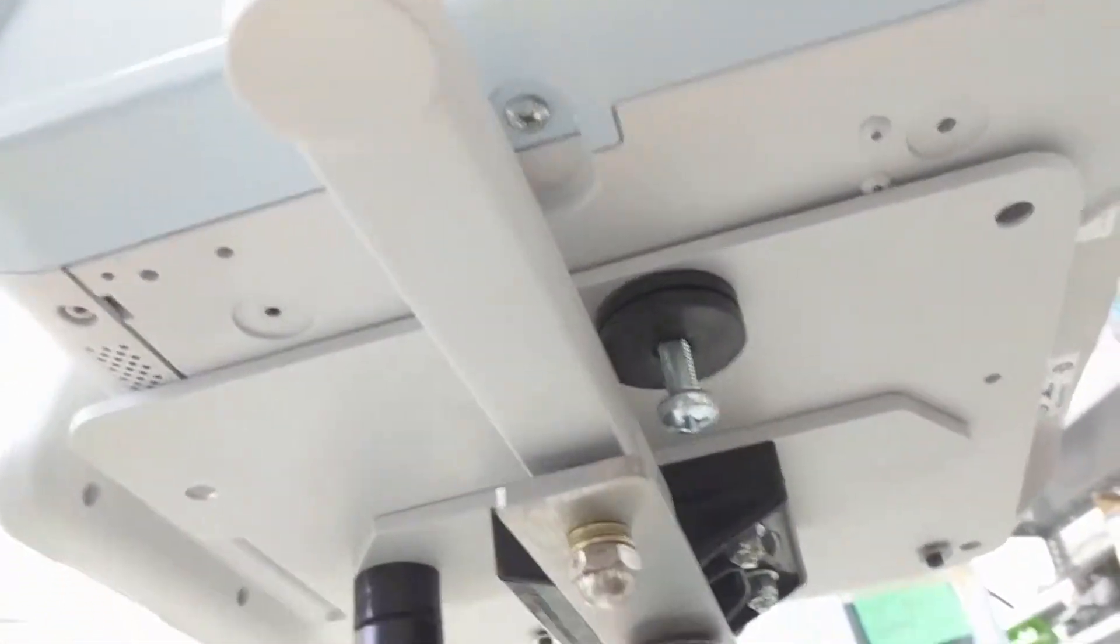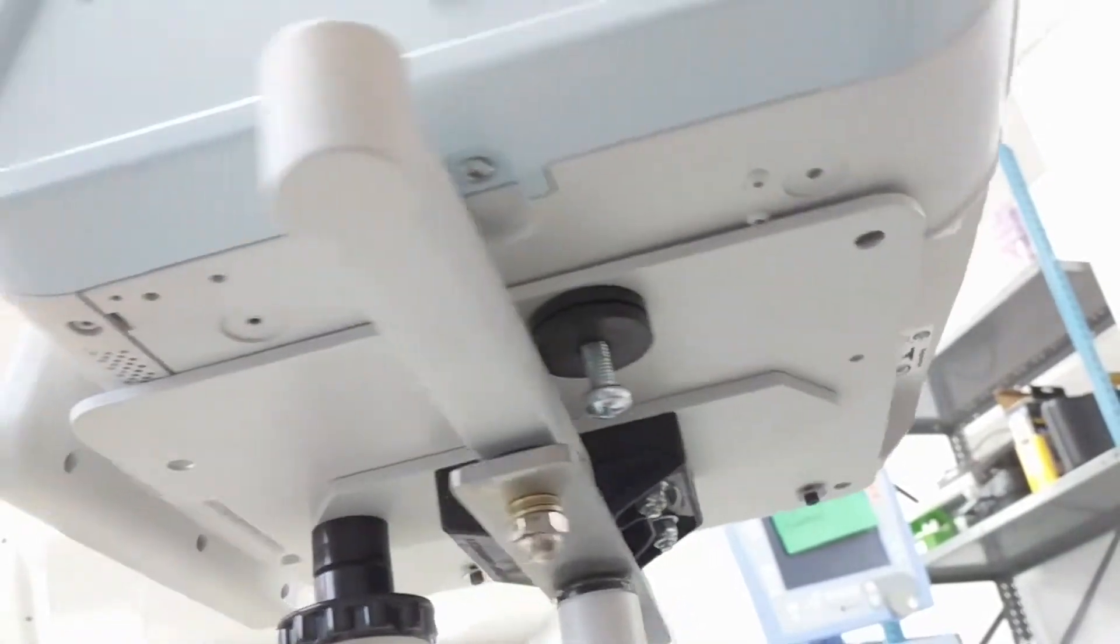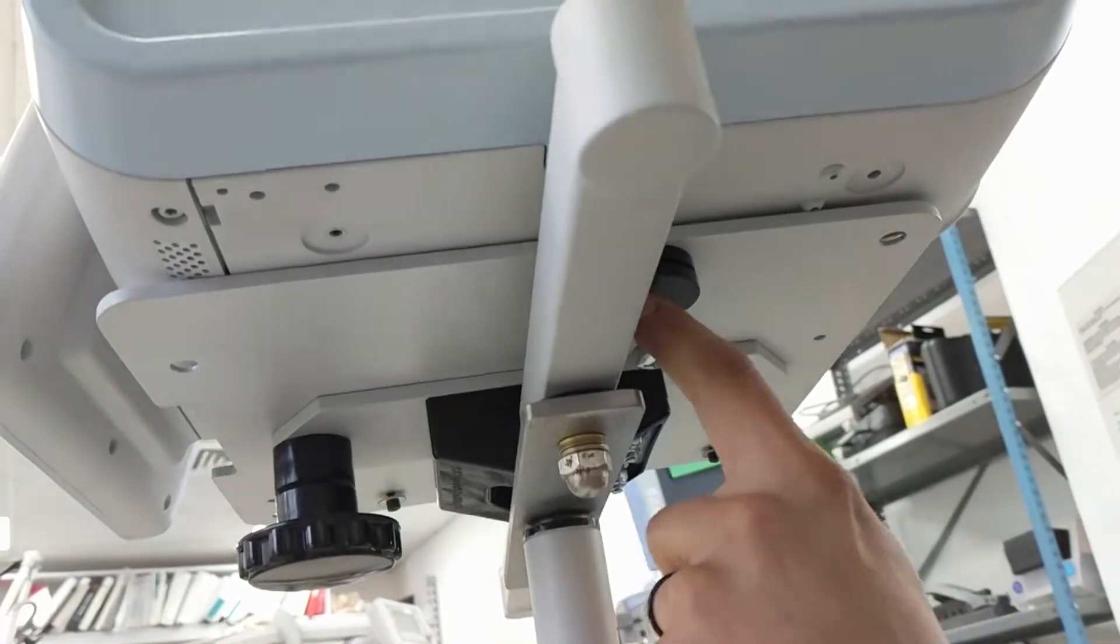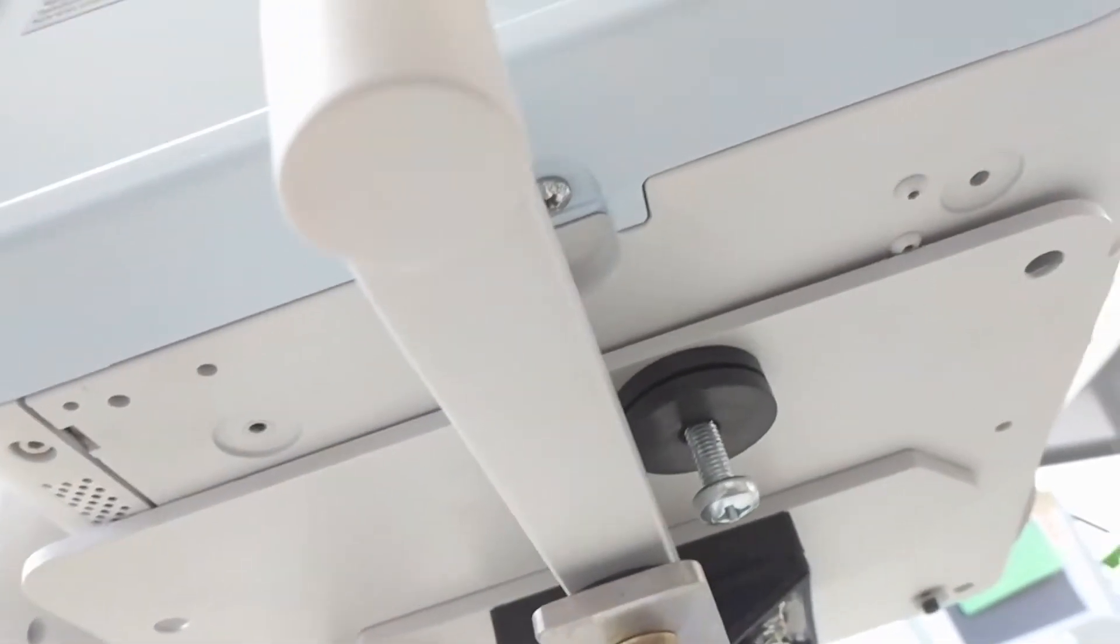All right, so we have the bottom section of the V60. So this is the unit facing you. As you can see, this is the larger front hole. This is the screw that you want to put in first.